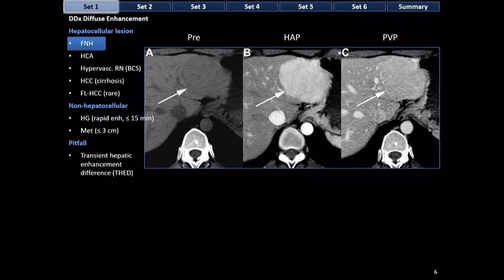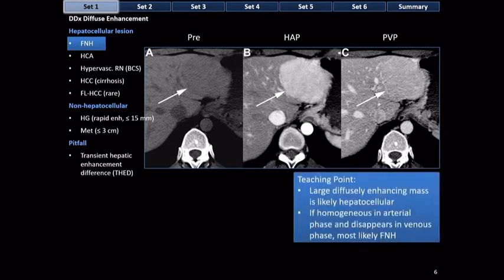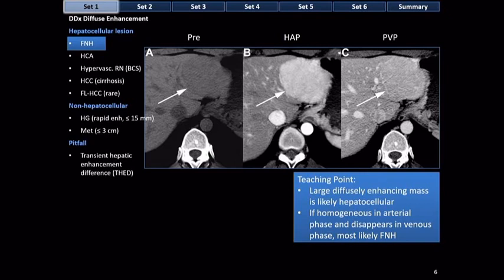This is a young woman, and the lesion disappears in the portal venous phase, so the most likely diagnosis is FNH. Teaching point: a large diffusely enhancing mass is likely hepatocellular if homogeneous in the arterial phase, and if it disappears in the venous phase, it's most likely focal nodular hyperplasia. You can't make the diagnosis with 100% certainty, but in your report you can say this is highly likely to be a benign FNH and suggest additional imaging such as contrast-enhanced ultrasound or MRI with a hepatobiliary agent.